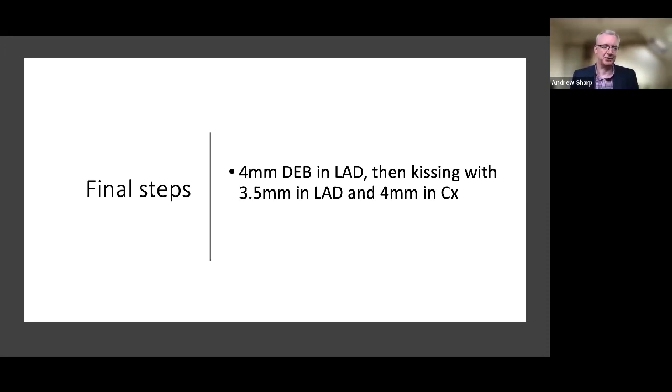If you've decided that the stent is protruding out of the ostium of left main, and you're a bit worried about taking all these balloons in and out in case you catch the ostium of left main, just have a look with your imaging device. And if you've got a perfectly round, fully expanded stent, you don't need to take any more balloons there once you've done your kiss. In the end, imaging gives you advantages that prevent you from making unnecessary steps and unnecessary mistakes.